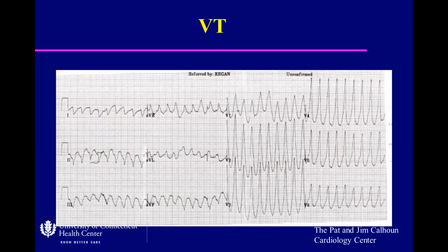VT. Who said that? John. John, okay. So John made the diagnosis in, how long did it take you, John? 5 seconds? Yes. Okay, good. So John heard this lecture before, so he made the diagnosis in 5 seconds. So everybody, after the lecture, needs to be able to make this diagnosis in, I give you 15 seconds.